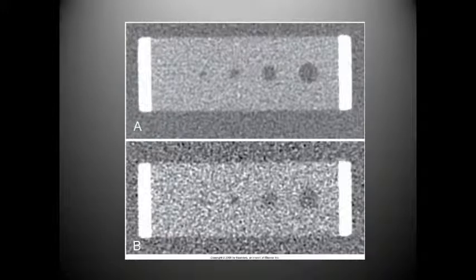So here we have low contrast detectability, and we have not really high contrast objects. We have an area that's got a certain type of density, and then what we're looking for is the ability to image these circles. Notice on image A we can find 4. Image B, on the other hand, we can see 3. So this would mean that A has a higher low contrast detectability versus image B. Here we see this applied once again. We have 1, 2, 3, 4, and potentially maybe 5 here. We have on image B 1, 2, 3, 4. So obviously image A has better low contrast detectability than image B.